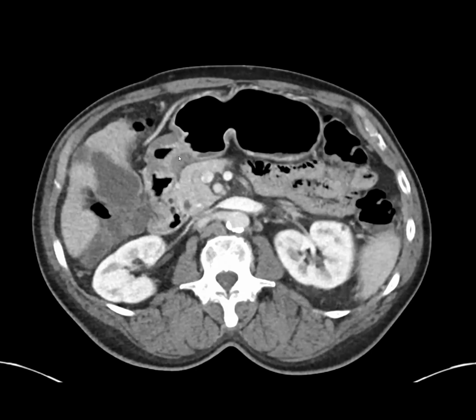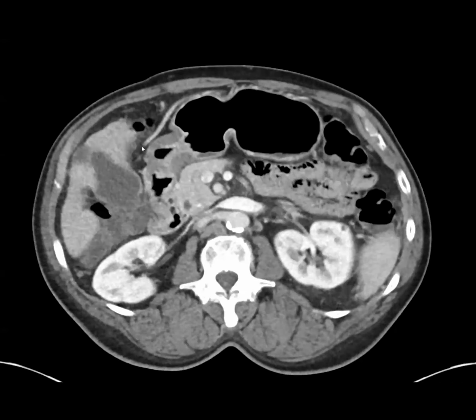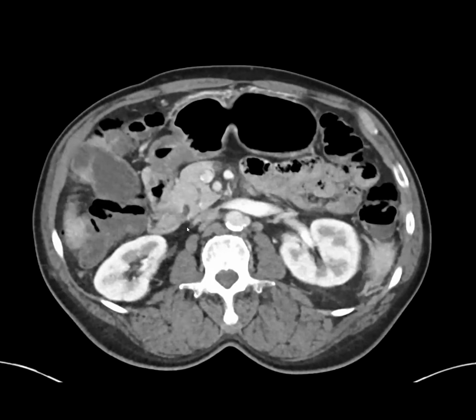Yep. And I point this out because when one of my trainees got the history of duodenal neuroendocrine tumor, they were like, okay, 4-centimeter circumferential apple core thickening of the duodenum compatible with known neuroendocrine tumor. So I guess one point is that the pylorus can be really thick, especially when contracted. And this is kind of the antropyloric channel. The pylorus is the muscle over here. But normally in the GI tract, if we see something apple core, we think about a malignancy, but just know this region can just kind of contract.